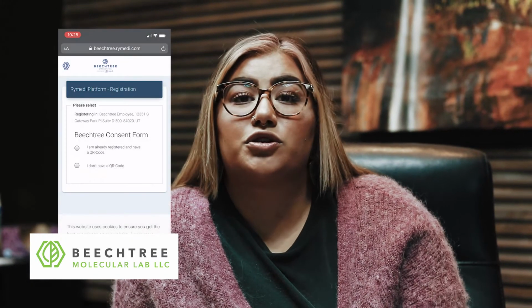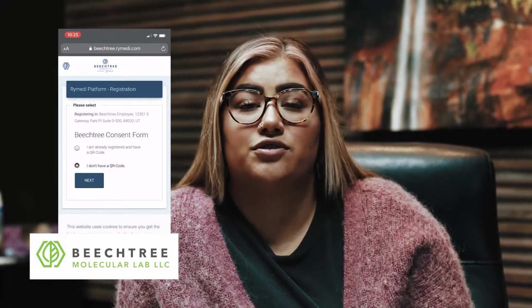They'll get their own personal QR code after that, and you'll go ahead and save that to your wallet. Take a screenshot of that and save it into your camera roll. That way if you test with us again, you just have to scan that QR code.